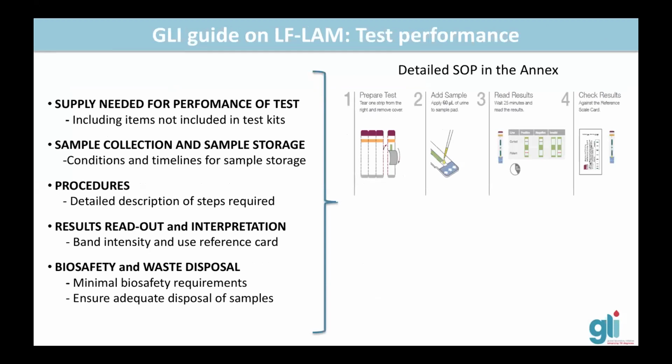The guide also includes guidance on test performance. I want to highlight again that there is a detailed SOP included as an annex, and the GLI guide provides information on the supplies needed for performance of the test, including items that are not included in the kits provided by Alere. The sample collection and sample storage conditions and timelines are also described.